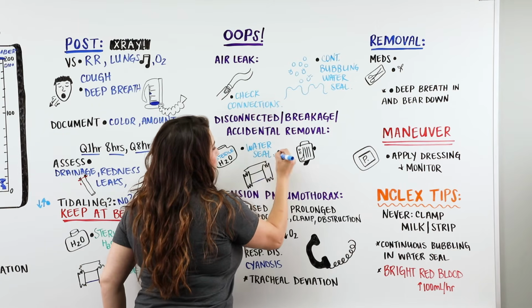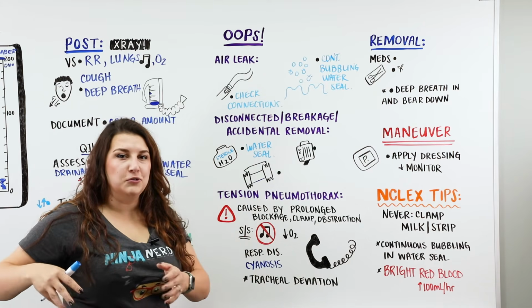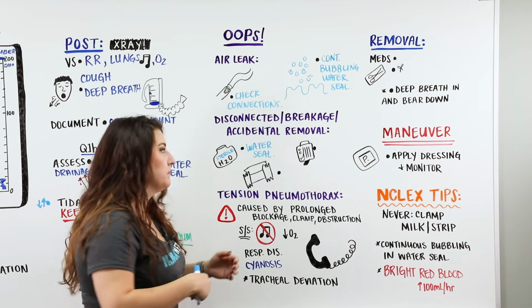What's that water seal for? Why are we doing that? We're doing that so that the patient isn't starting to give themselves a tension pneumo by breathing in that air into that pleural space, and now all of a sudden we have another problem.